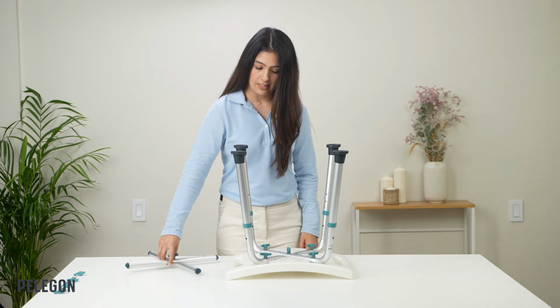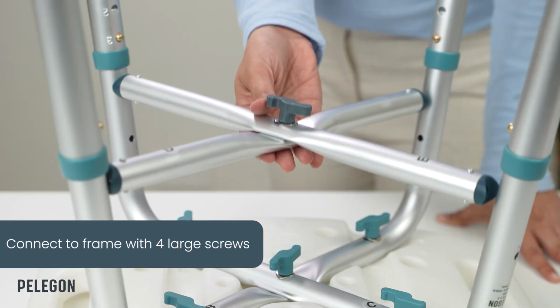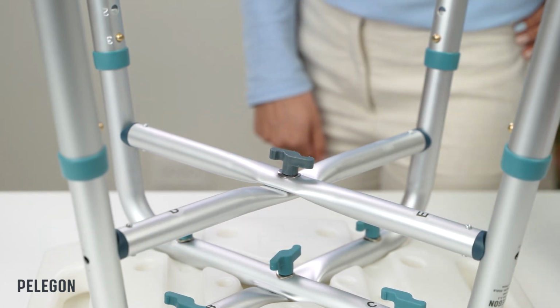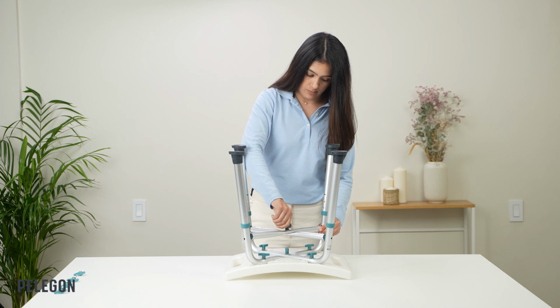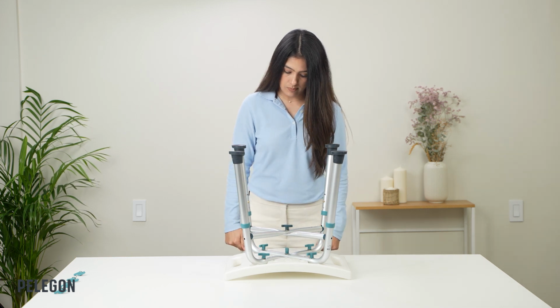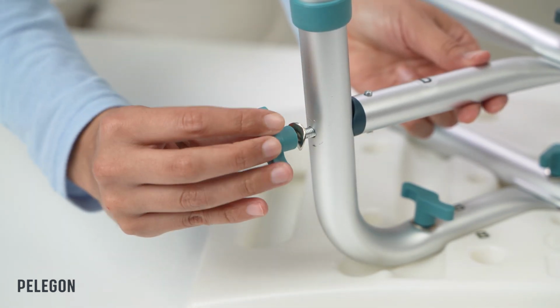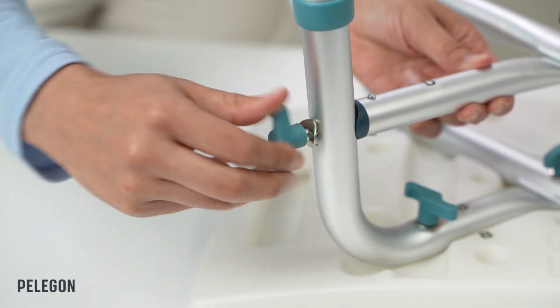Once the crossbar is ready, we will connect it to the frame by using the 4 large screws. You'll need to make sure that the holes of the frame and bar are aligned. Once you begin to tighten the screws, you may need to hold the washer in place and apply some pressure for optimal fit.